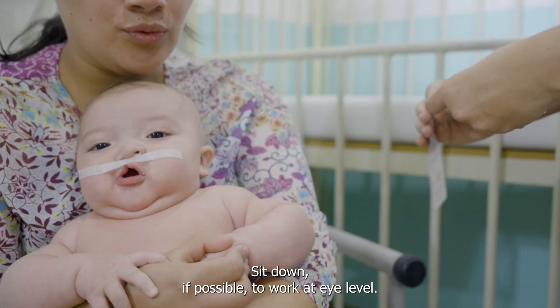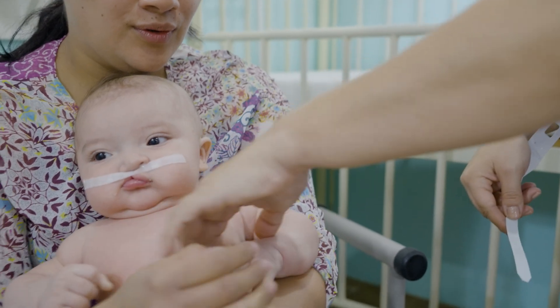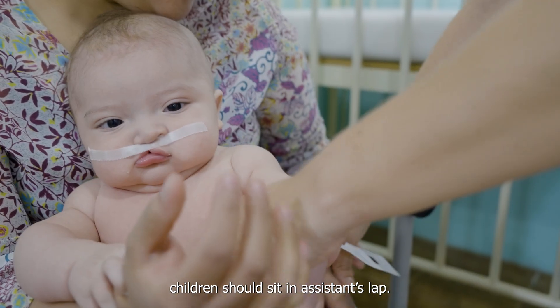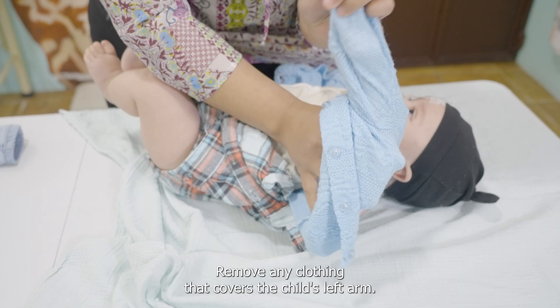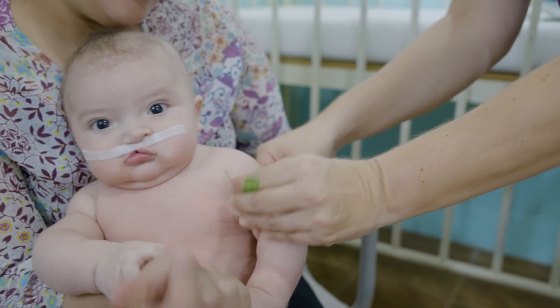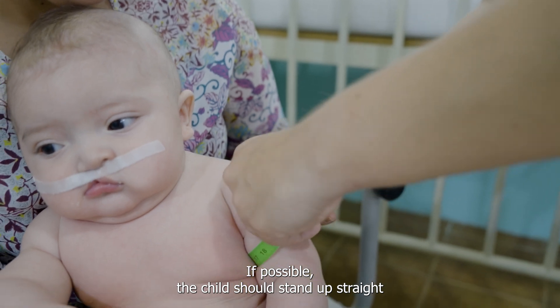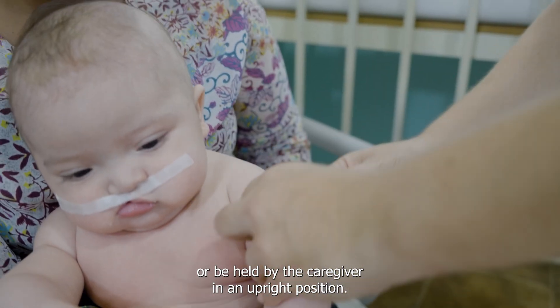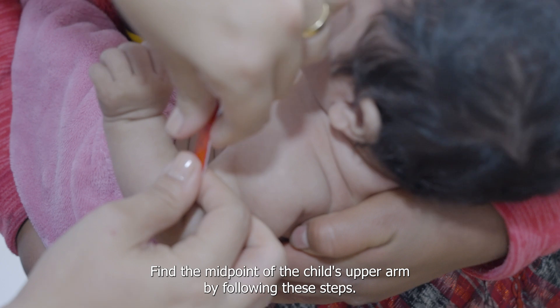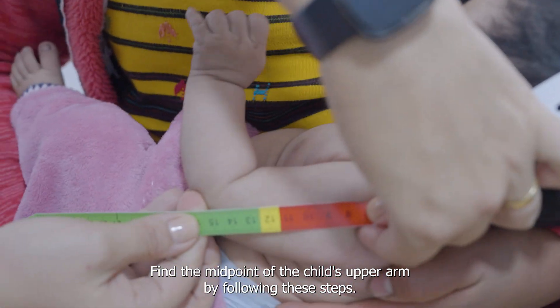Sit down, if possible, to work at eye level. Infants and young children should sit in the assistant's lap. Remove any clothing that covers the child's left arm. If possible, the child should stand up straight or be held by the caregiver in an upright position. Find the midpoint of the child's upper arm by following these steps.